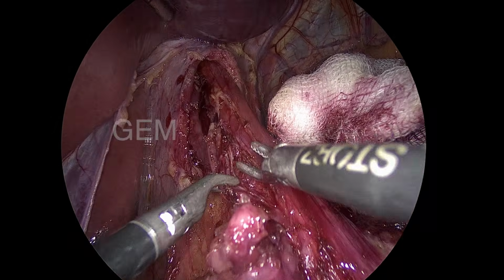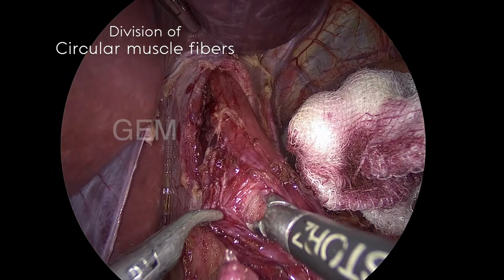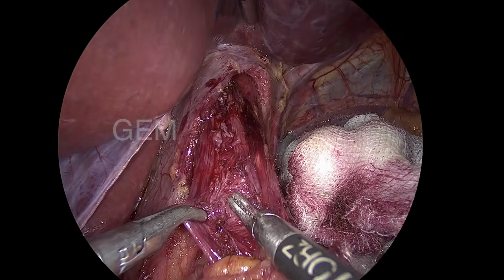So I am coming down now, and again 2 centimeters from the OG junction I started separating the circular muscle from the mucosa, and then I am dividing the muscle. This is called division of circular muscles.